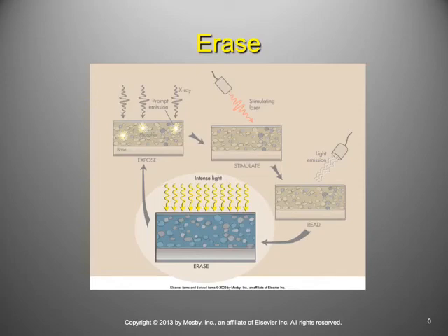And it's best to use the image plates soon after erasing them because they are sensitive to natural background radiation. They can be fogged by radiation. So you all know that whenever we go into the lab, I ask you to go ahead and erase the CR cassette before you do an experiment because it may be fogged. We haven't used it since last week. It hasn't been erased since last week. So it might have some fog in it, and that could significantly impact our images.